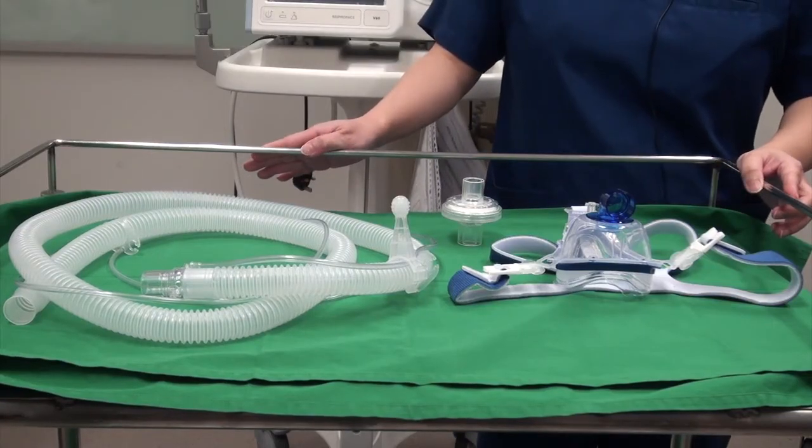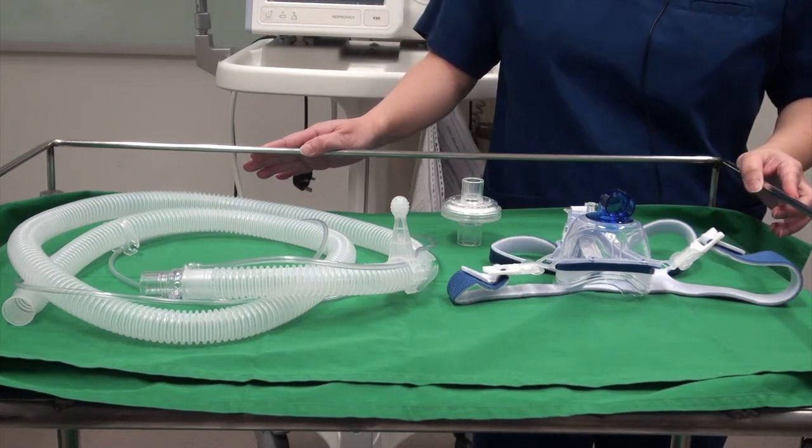I will now go through the accessories required to set up the V60 NIV machine.